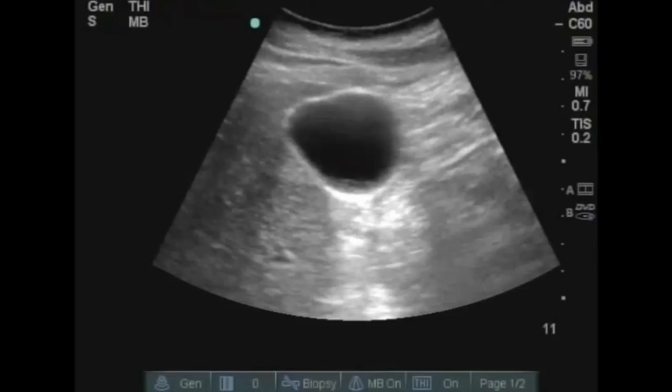You can see here in this image of a gallbladder that we have normal liver tissue traveling through some fluid. We have a posterior acoustic enhancement in that area, and it's hyperechoic to the normal liver, not behind the gallbladder. And we have an area that travels through more fluid, so the beam is even less attenuated with a much greater degree of posterior acoustic enhancement. And you can see that that is hyperechoic to the second area and hyperechoic to the first area. So you can see that there are these three different areas that show you the difference of posterior acoustic enhancement, telling us that that structure is fluid filled.